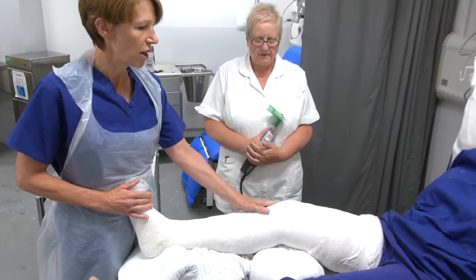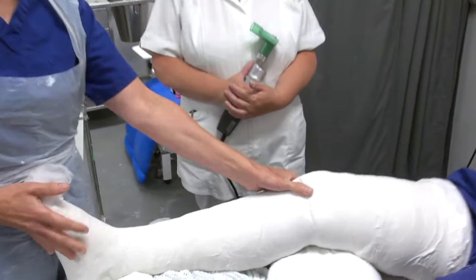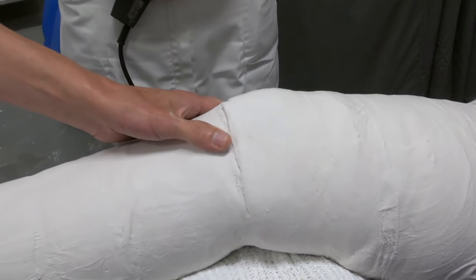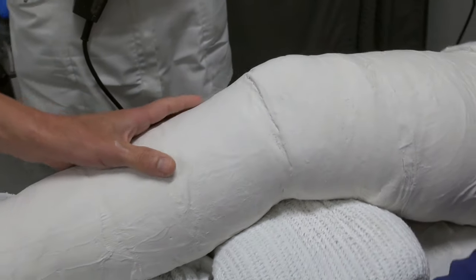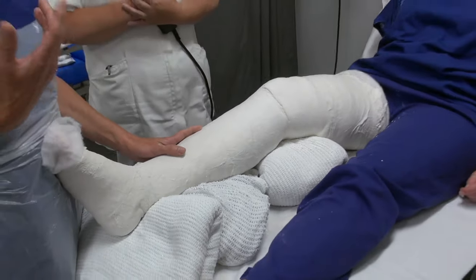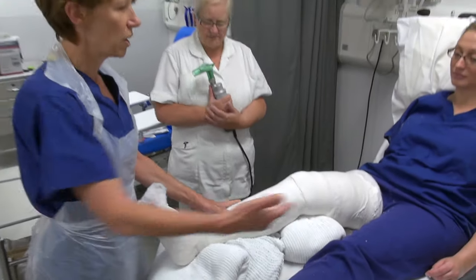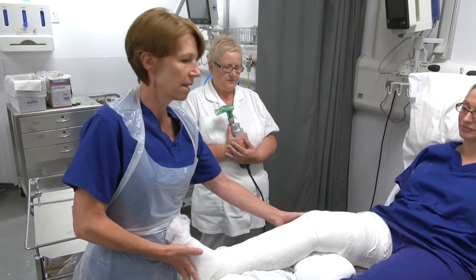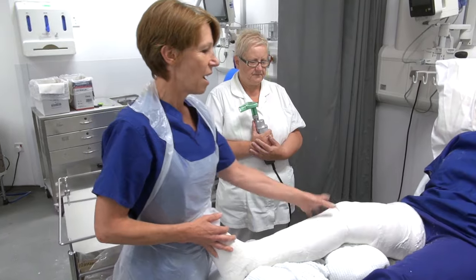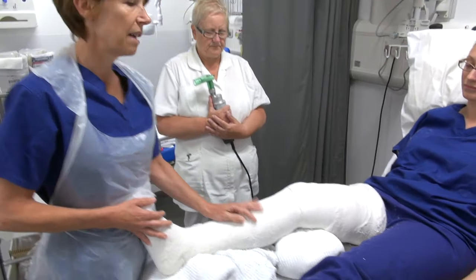During the demonstration, we did allow the knee to drop slightly, so that has caused a little bit of a crack through the middle, which is not ideal and not what we want. Ideally when this plaster is put on, you would have a third person assisting who would help to hold the knee in place from the other side. For the purpose of filming that was difficult, which is why we have this little crack — but we shouldn't have that.